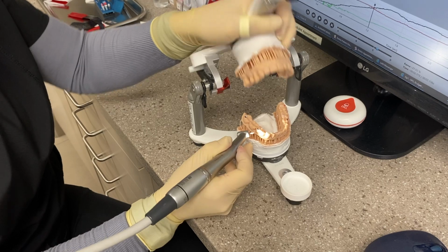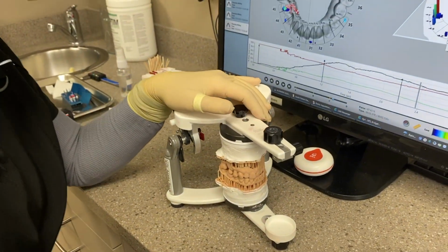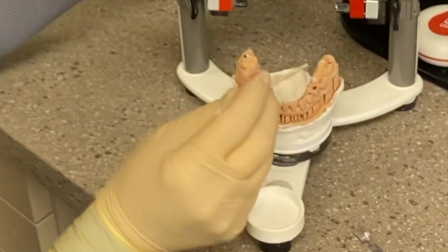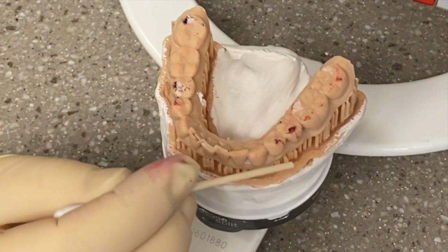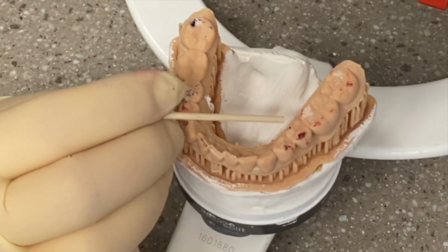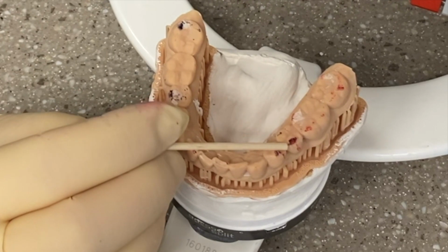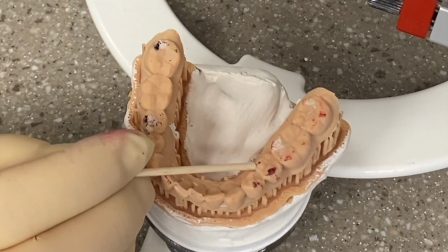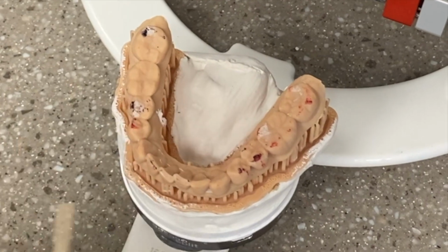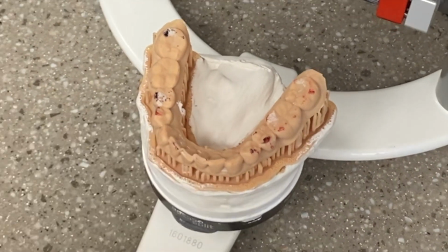And yes, you want the buccal cusp sitting in the fossa, but you don't want it as an interference. Sometimes it's not the big contact that you think it is. You would think it's the obvious one. It's the little interference right there that's hitting in the wrong spot. So look at the difference in the size of this articulating paper mark and then this one. And really, when I pull shim stock, this is the culprit, not that one. So I'm just going to take this one down a tiny bit.